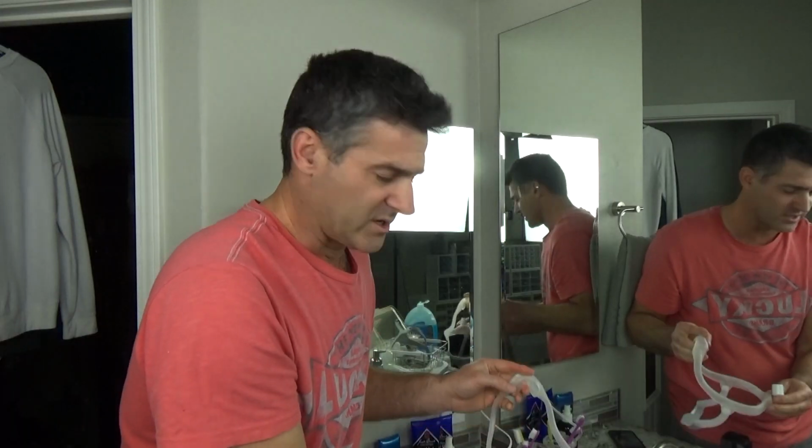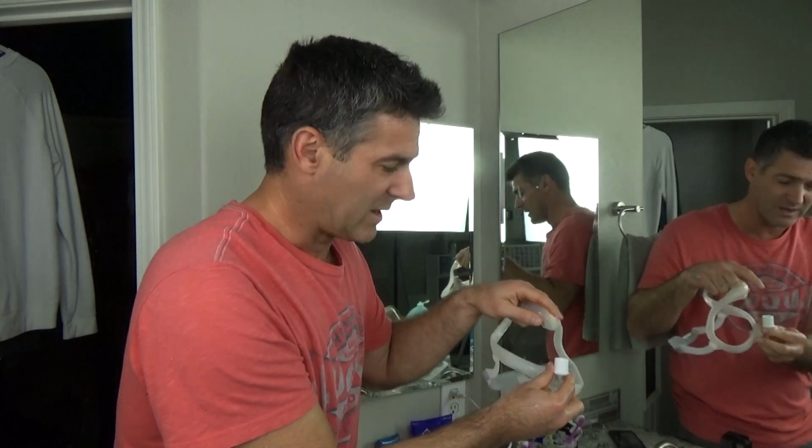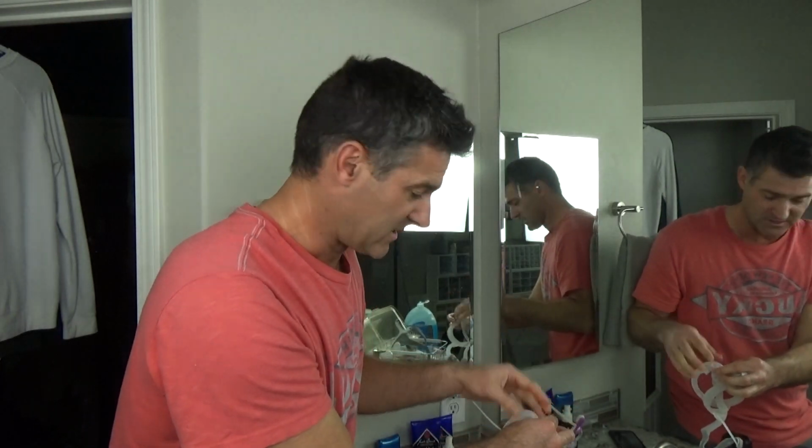I'm not going to do it with Dawn dish soap, but I'm going to do the exact same thing. I'm going to put a couple drops right in here in the top. I'm going to rinse the water in, and then I'll kind of suds it around and get the nose piece, whatever comes in contact with my face. That's really all I care about as far as cleaning the mask. So now that it's totally rinsed off, I'm going to drop it in the hurricane dryer.